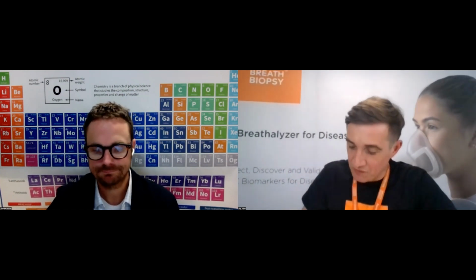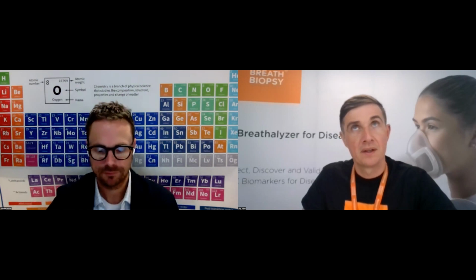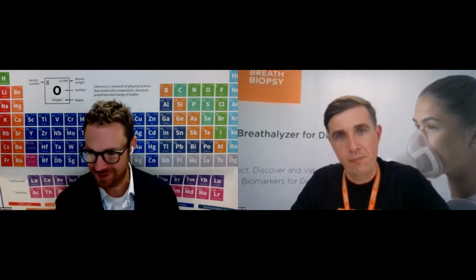And from a hardware perspective, so I agree that you don't want to limit creativity, but do you think things such as using cleaned air for the subjects to breathe in, are there certain things that you can do at the front that will help from a data quality standpoint? Yes, so there is, but it's all related to your ability to control those things, right? So using the receiver, obviously you can provide clean air to the participant.